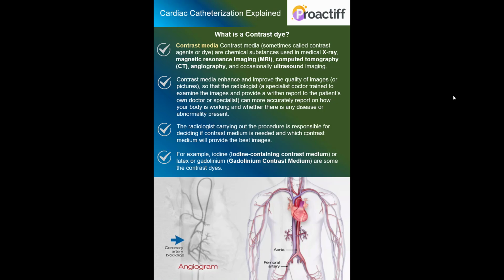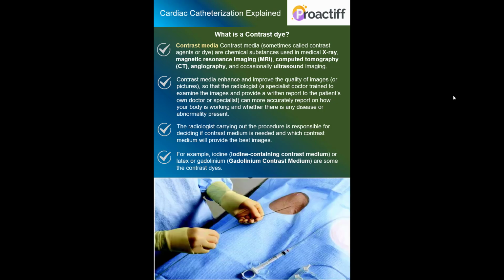Though not for the heart, for kidney conditions also this type of contrast dye is used. So this gives you a perspective of what contrast dyes are and their critical role in producing top class imaging so as to identify the issues and to easily conduct the procedures.